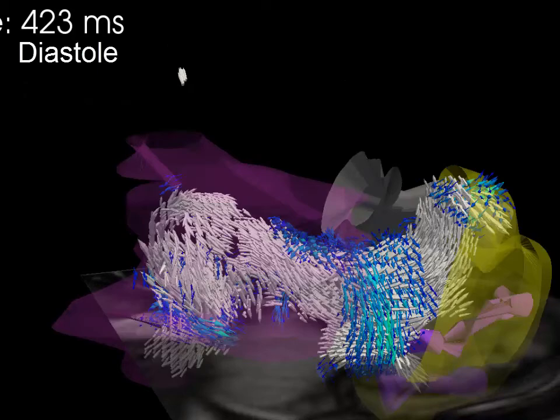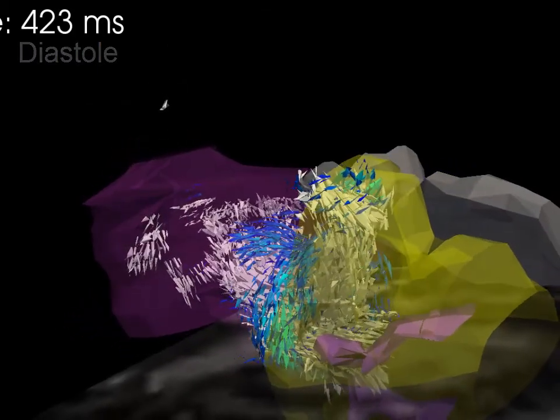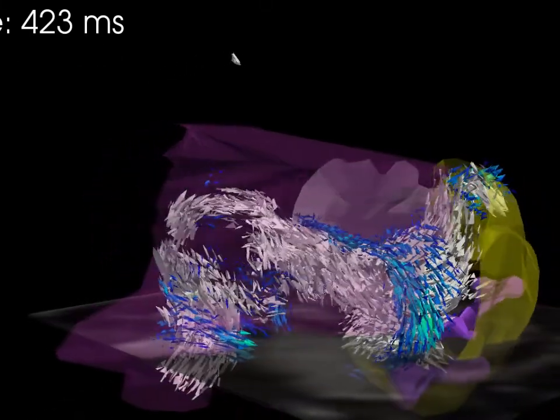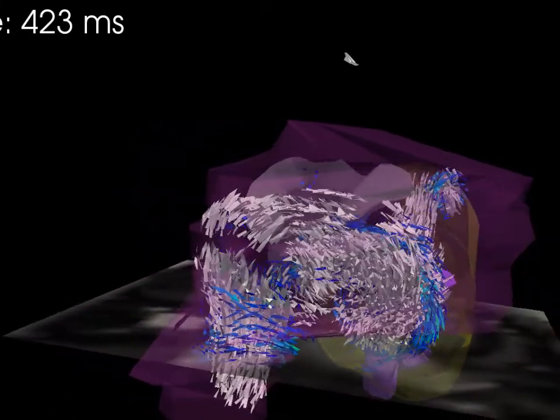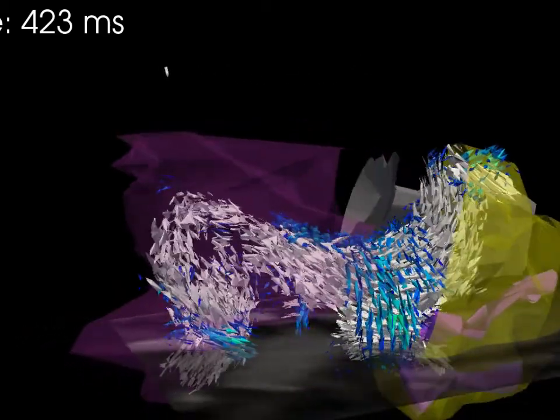In early diastole, we have flow coming up the IVC, corkscrewing through the right atrium into the right ventricle. Now we delete the atrial flow for clarity.